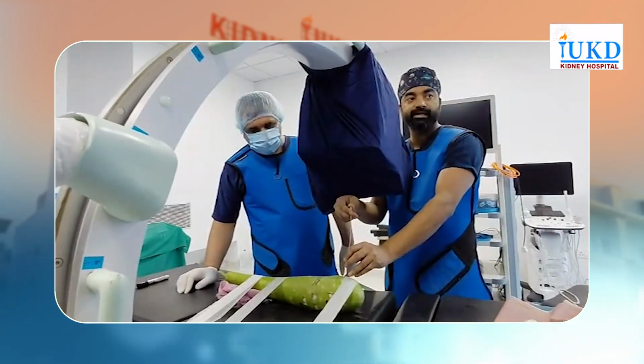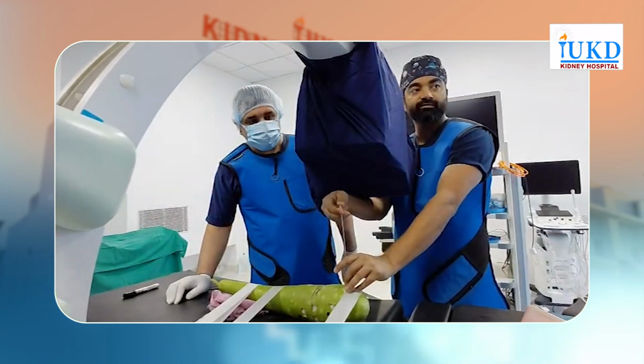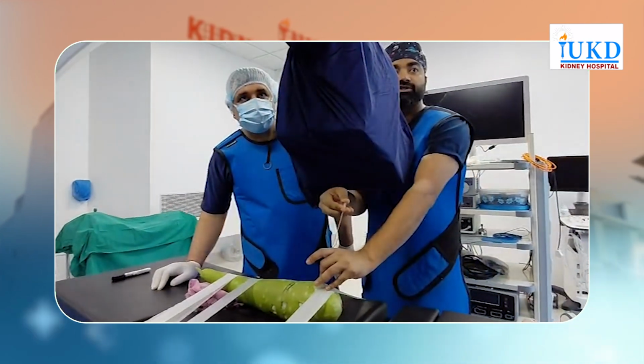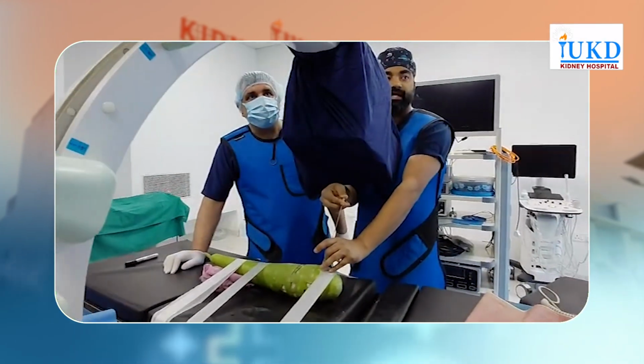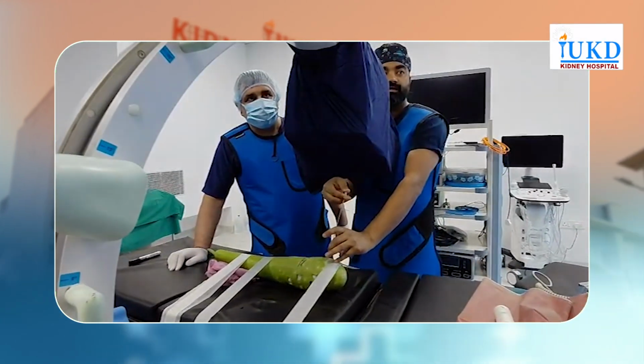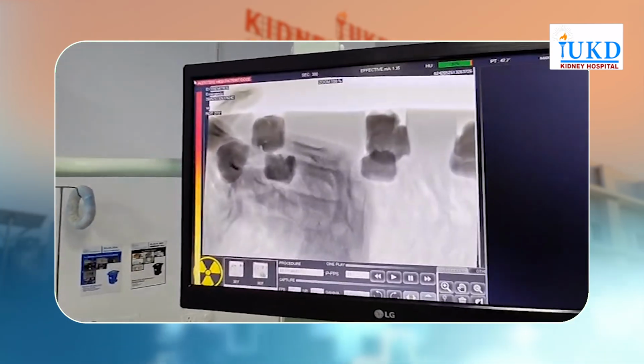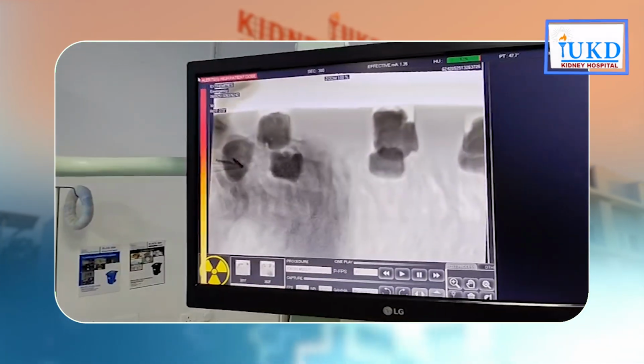You fix your point here. Fix it with your lower finger. This is at the calyx. Now bullseye is like you shoot an arrow, right? Like your eye, a bullseye, right? Your needle should not see a curve. Okay, only this target. Okay, you go deeper. In stone cases, you will feel the stone.